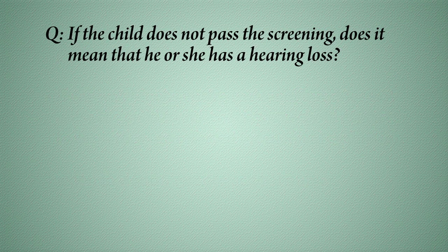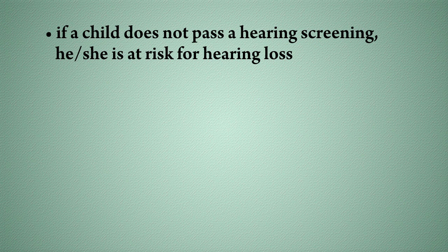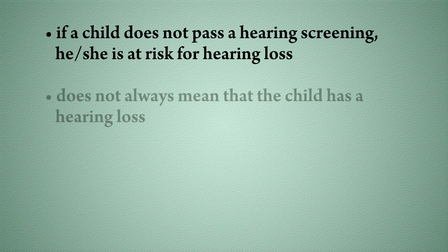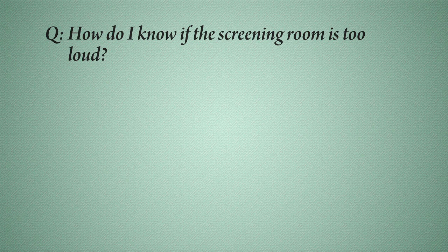If the child does not pass the screening, does it mean that he or she has a hearing loss? If the child does not pass the hearing screening, it means he or she is at risk for hearing loss, but it does not always mean that the child has a hearing loss. Without an audiological evaluation, it is not possible to say. How do I know if the screening room is too loud?